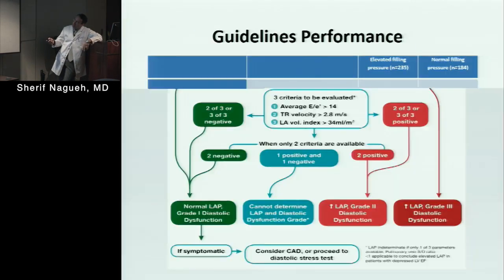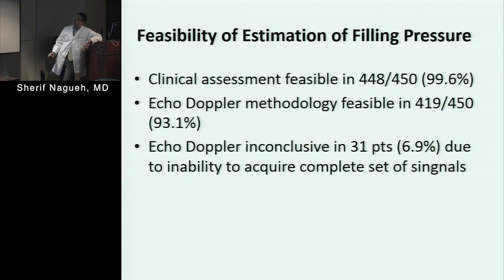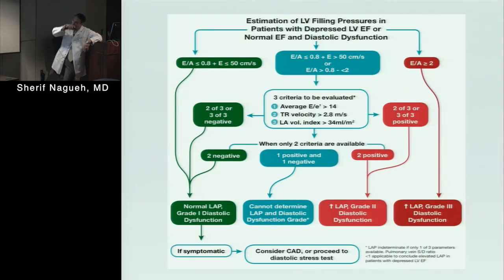So, hold on, go to the previous slide. Next slide. Just to clarify, so that light blue region, that was 6.9%. That's correct? Yes. Because only in 7% of the entire population you ended up in that blue range, and you say cannot determine because we want to have at least 3 criteria, and it happened that we had 1 or 2. That's fine. That's pretty good, actually, in real life. So that explains why it was.